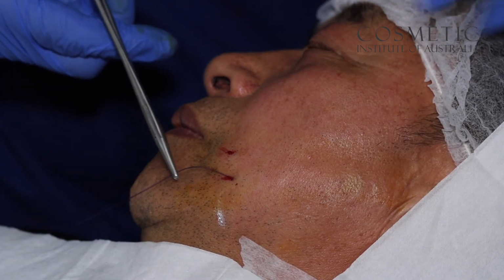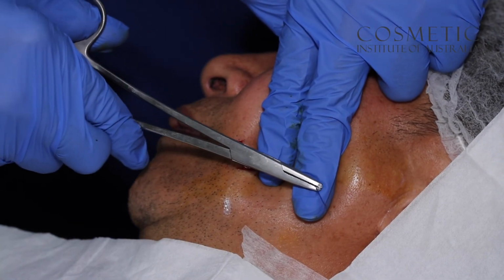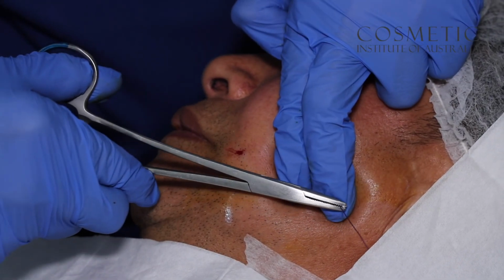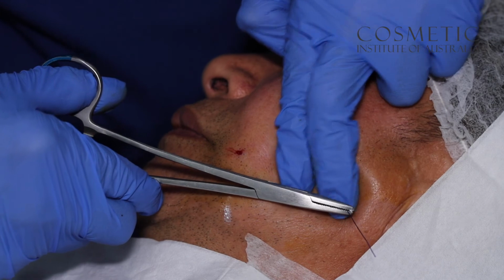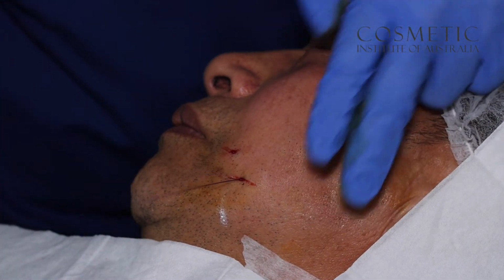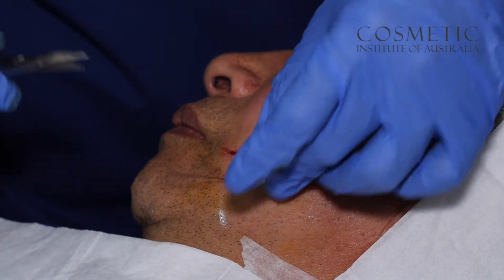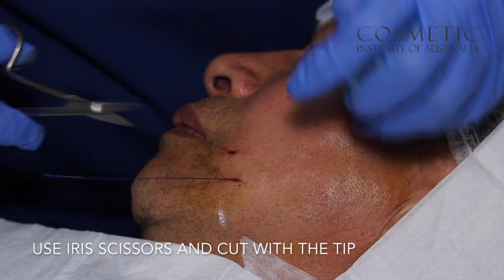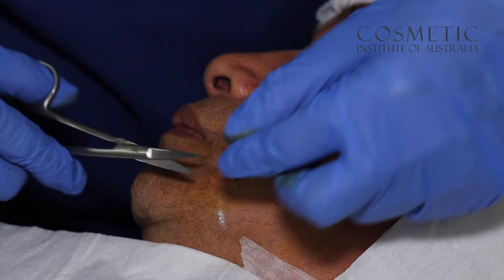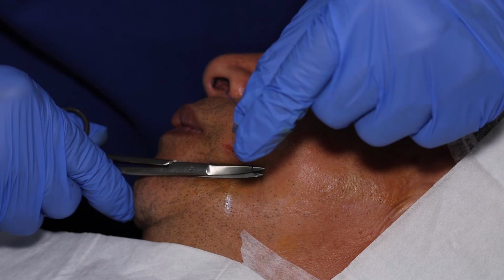Firstly, use one hand to press on the thread and gently pull. Next, further traction is performed by pulling the thread in the opposite direction. Once the thread is engaged, use a pair of curved iris scissors to cut the thread. Depress the thread at the insertion point and cut off the excess. The end of the thread should retract completely into the opening and no thread should be visible.